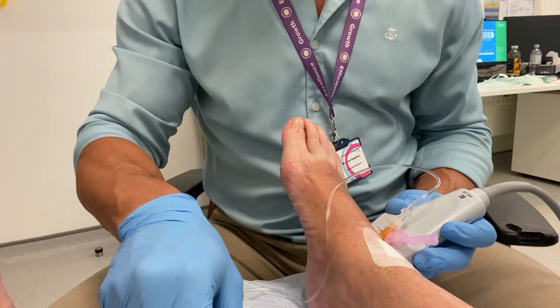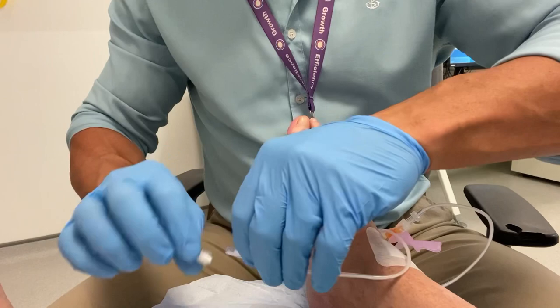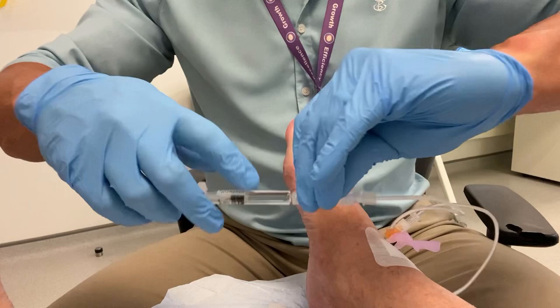Here I'm filling the line with the corticosteroid — in this case I'm using Depimedrone, which tends to be my preference. And this is the Ostenil, or hyaluronic acid, and so we begin to fill the line here.